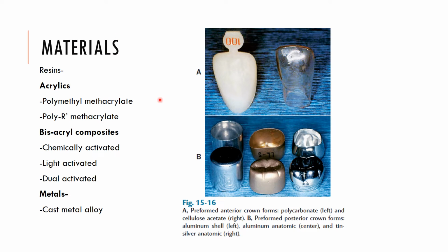Materials used are resins and metals. In resin, there are acrylics, that is polymethyl methacrylate. Bis acryl composites: chemically activated, light activated, dual activated. And then metals are cast metal alloys.